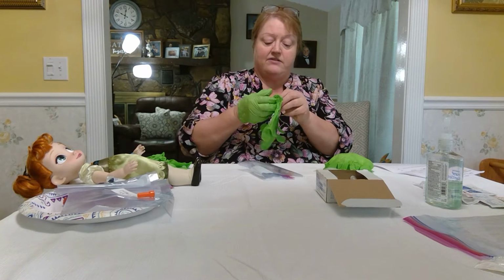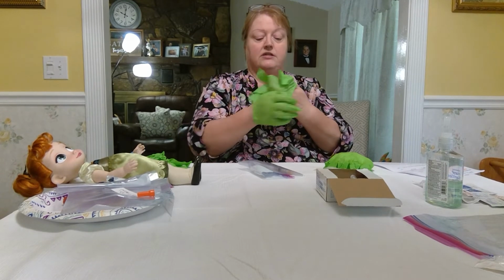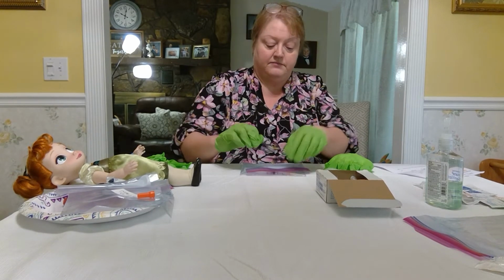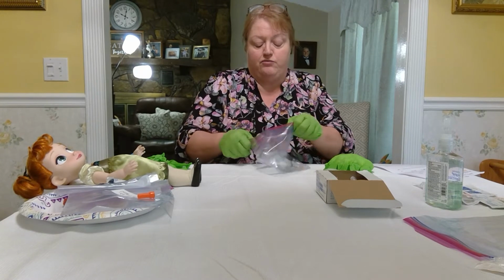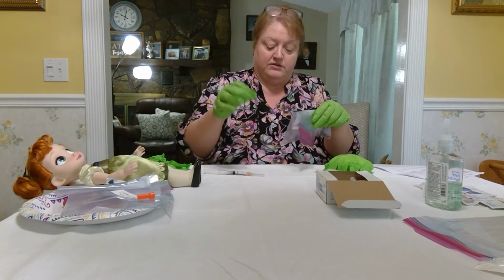It is invasive. There is the potential for blood interaction, so do not do this without gloves on. I prefer to change gloves every time, but it's not something you necessarily have to do unless they become soiled.